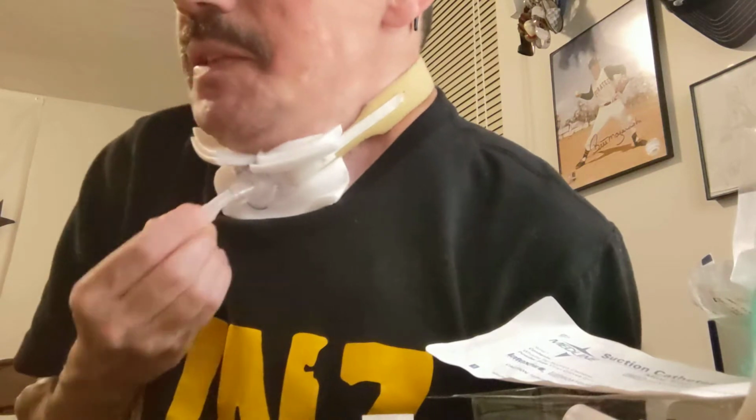But yeah, this is a Trach, and this is what I have now. It's actually a different version. I don't know if they've updated them or if it's just a different model. With this one, as you can see, you take the cannula out and there's just nothing there. Whereas with this one, you pull it out like that, and there's still a little thing there, so you can put the cap back on without having that issue.